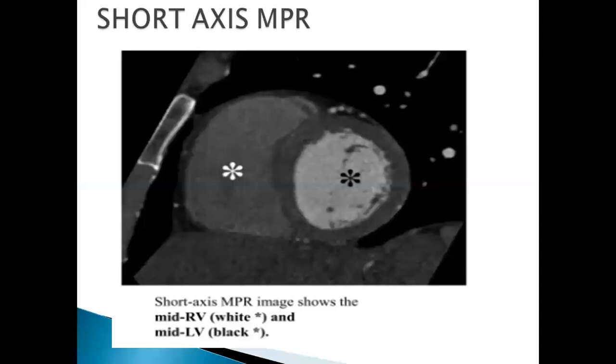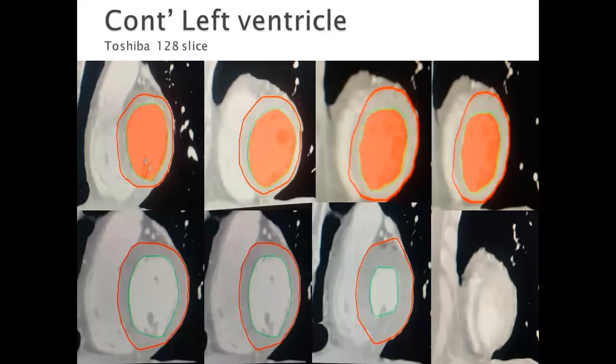Now, this is your left ventricle, the black dot. Specifically the left ventricle, you are going to start getting multiple segments from the apex of the heart right to the mitral valve. But remember, you don't want to include the mitral valve themselves for function. You don't want to include also the apex of the heart where there's no chamber.